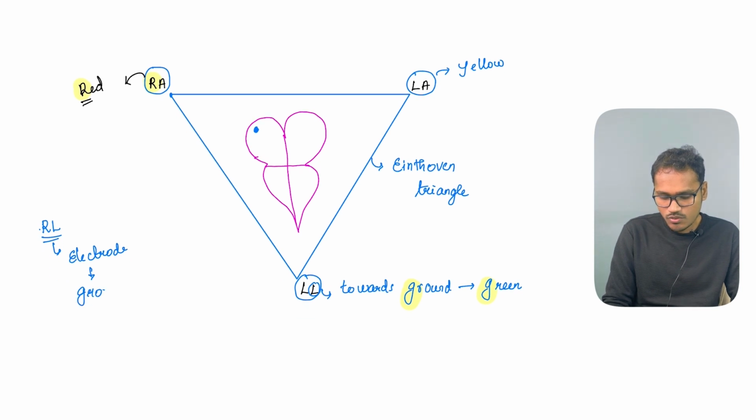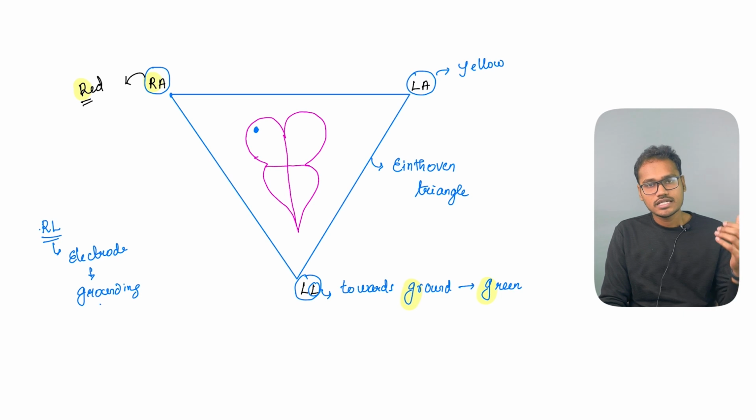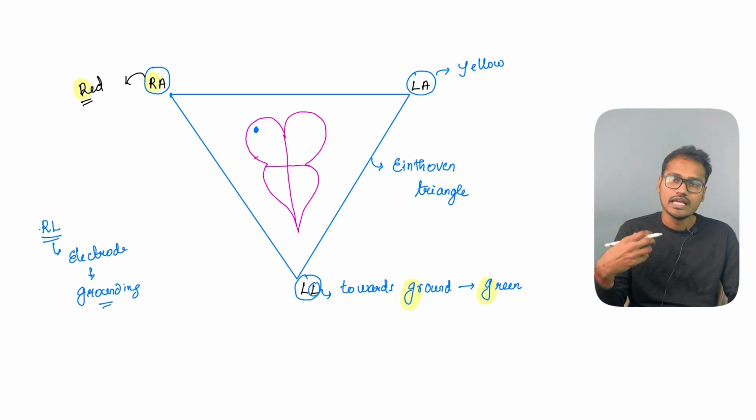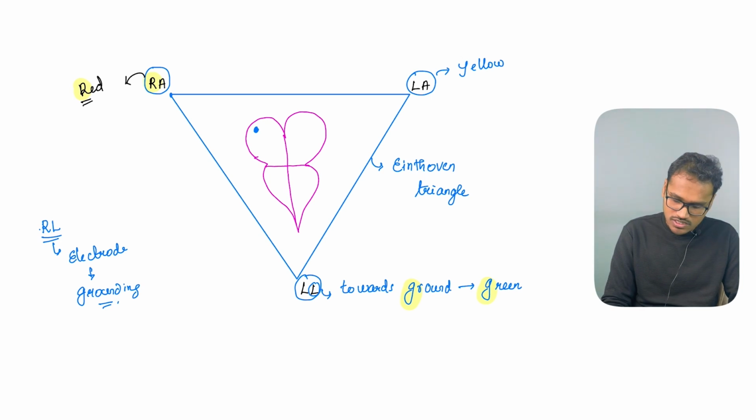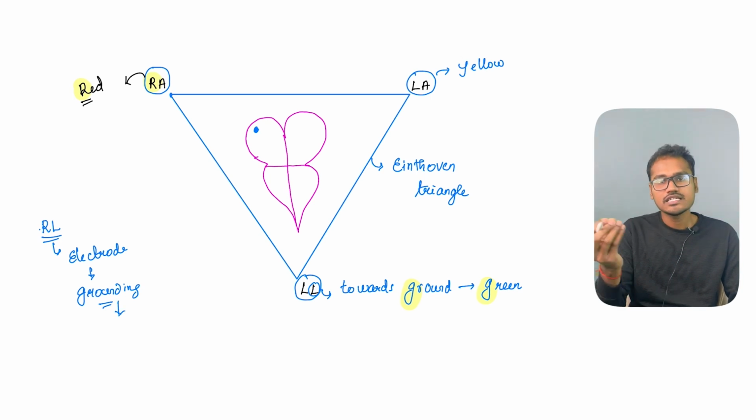So it helps to avoid any kind of electrical activity which is recorded that is affected by other interferences. That is, when the person is getting some kind of electrical mismatch circuit and some abnormal electric shock from the instrument, what will happen? This will be grounded easily. So this grounding electrode, like we see it in our day-to-day household circuits also, it is generally black in color.